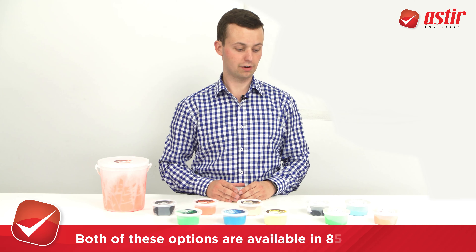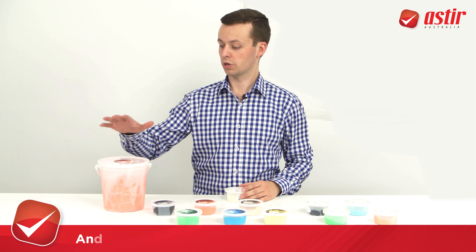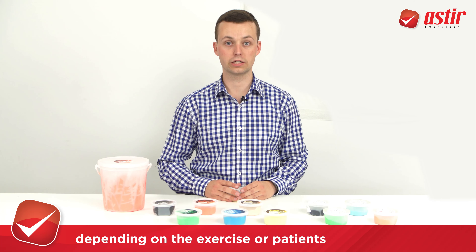Both these options are available in your 85 grams, which is great for patient take-home or resale, as well as your 2.3 kilo larger tubs which are great for distributing out different dosages depending on the exercise or patients.